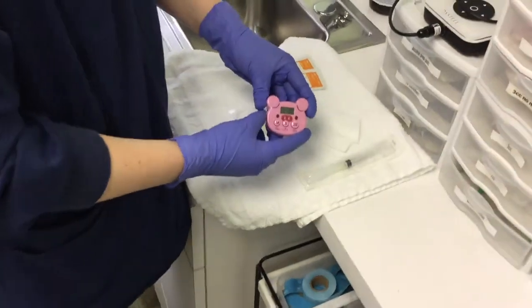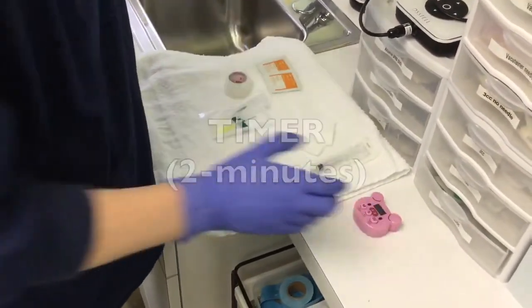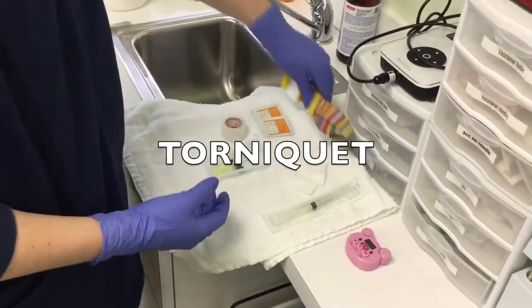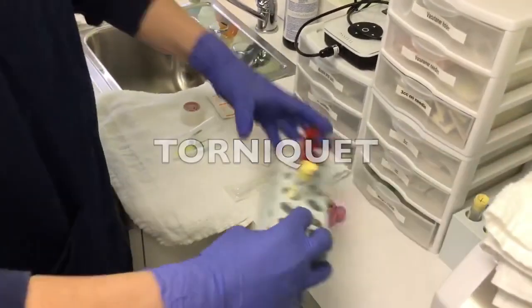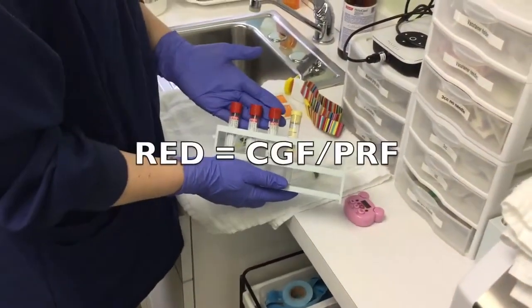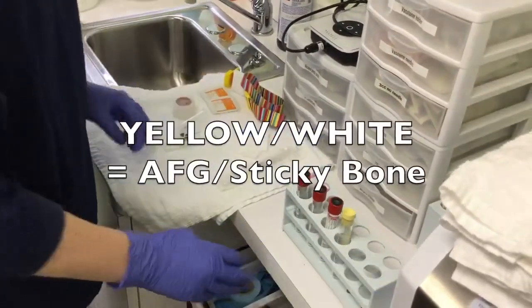We want to make sure we have a timer set to two minutes and a toner kit. For this procedure today, we'll be using three reds and one yellow, so we'll set that right off to the side here.